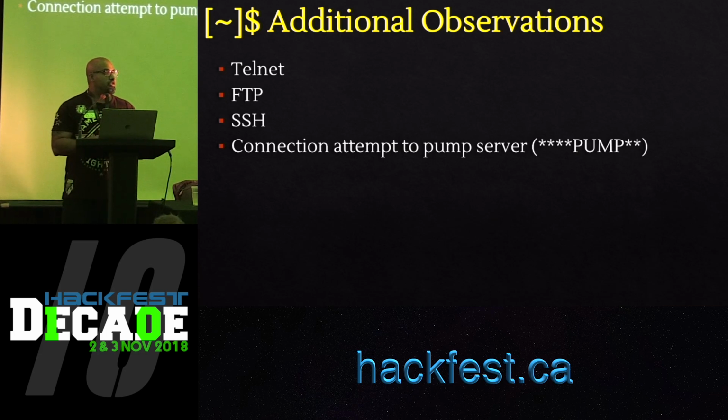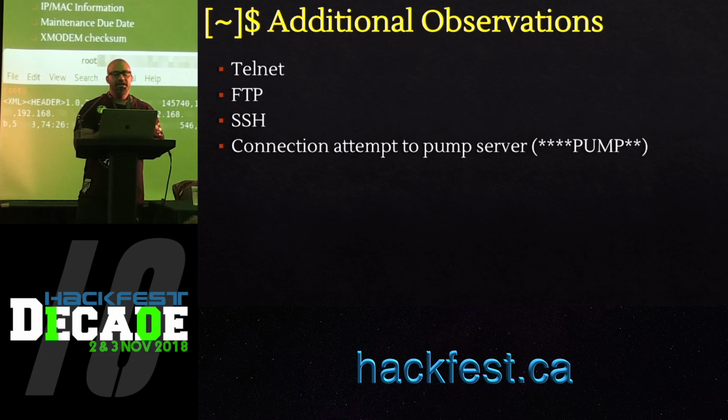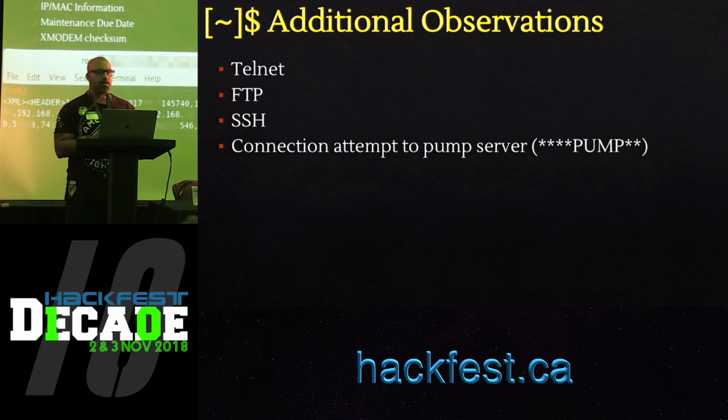So we spun up a virtual machine, gave it the same NetBIOS name the Infusion Pump was looking for, and just brought it up in the network. As soon as that happened, the Infusion Pump started to send packets to the pump server. We studied the packets for a while, and it looked like it was loosely based on XML, and we were able to extract certain parameters.